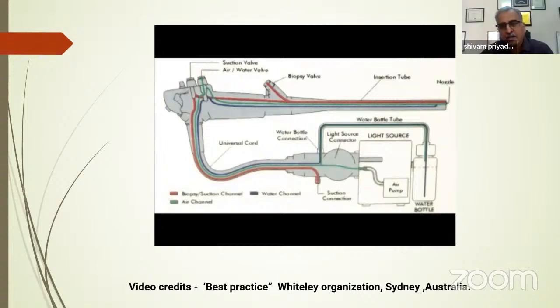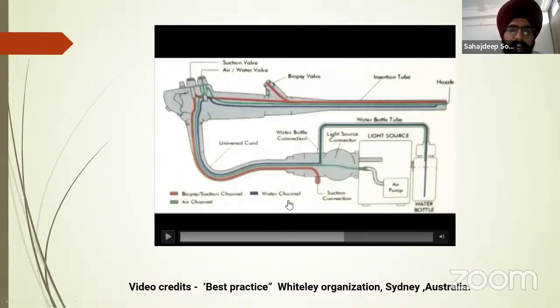That is why it is being used, sir. The second point is that if there is, by chance, a leak in the internal channel, the disinfectant can lodge there, and if the same endoscope is then used in a patient, it can lead to disinfectant-caused injury to the patient. That is why these two points emphasize the use of leak testing in any flexible endoscope before use.